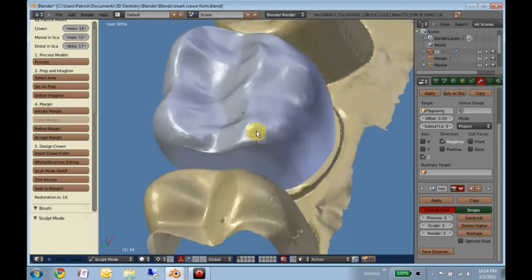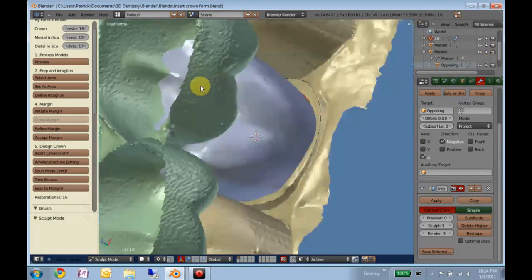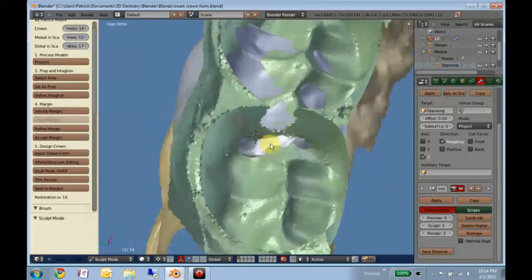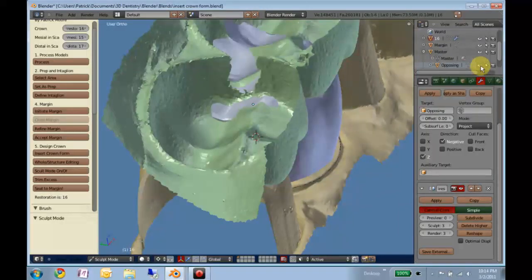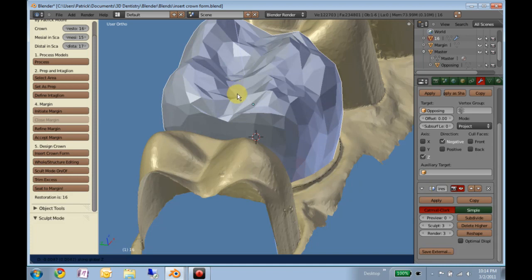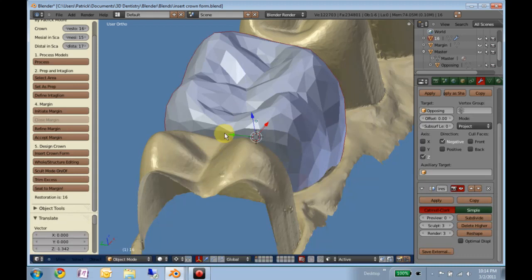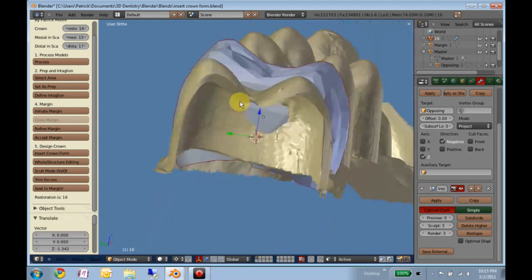I've got it set such that the opposing will always push it down so that it can't be made in hyperocclusion. So that's good. Put it back where it belongs. Right, and here you just want to get it close.